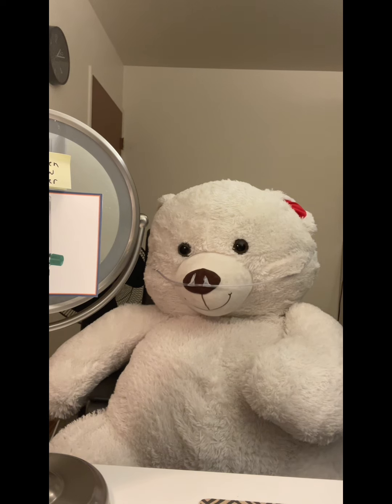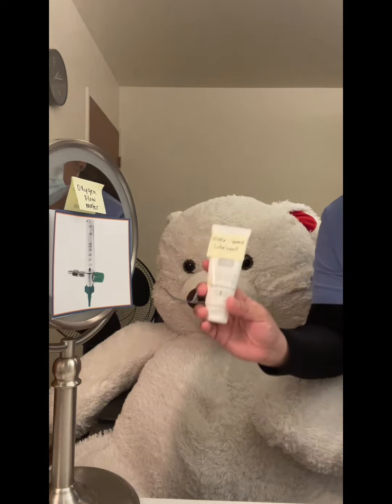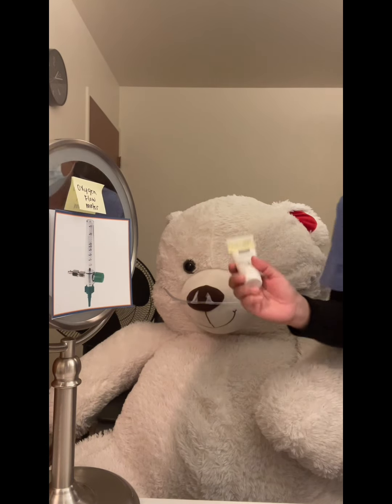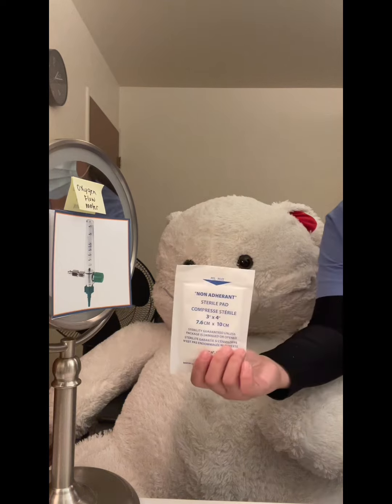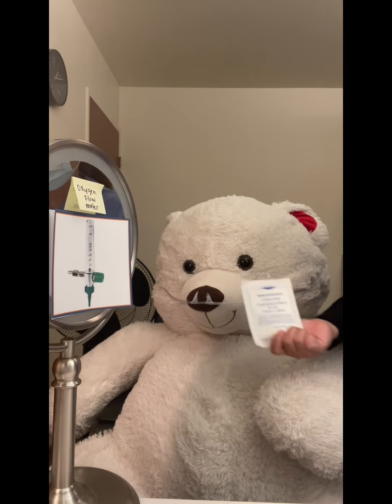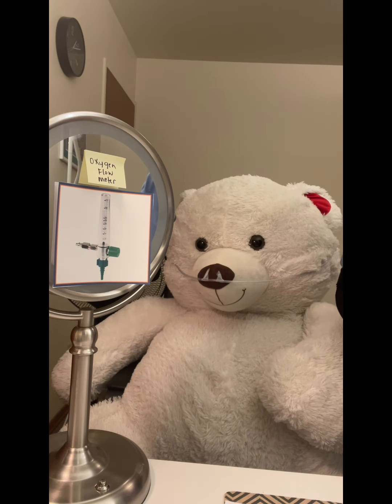Then I will assess the patient regularly. I will check if there's any irritation or discomfort, and remember that tubing should be secured but not tight against the skin. If the client has an irritation in his nares, I will apply the water-soluble lubricant to soothe the mucous membrane. And if there's any irritation to the client's ear from the cannula strap, I will put a gauze pad to relieve the discomfort. And then I will encourage the patient to breathe through his nose to receive the oxygen coming from the tank and not through his mouth.